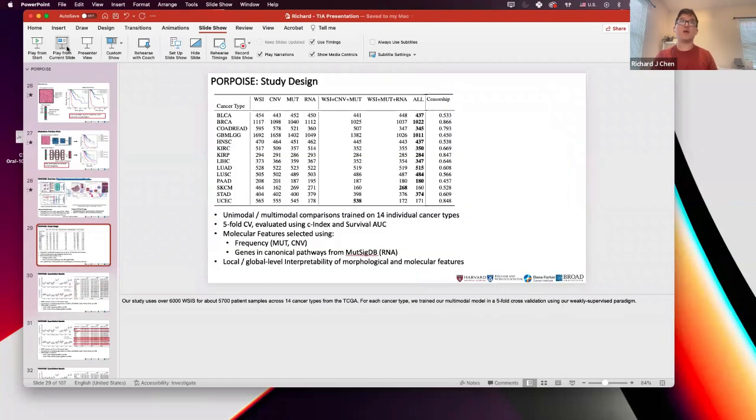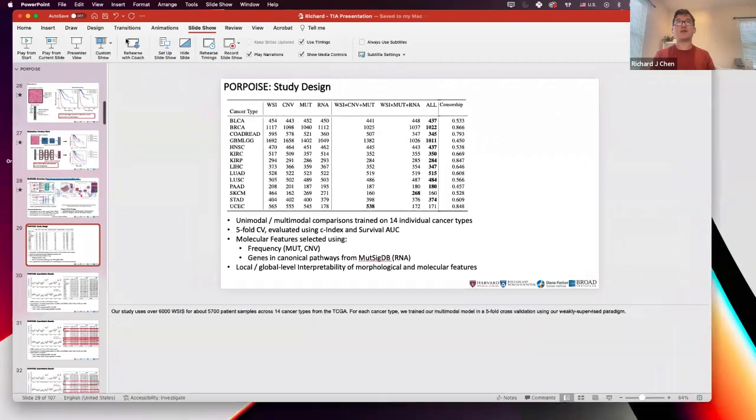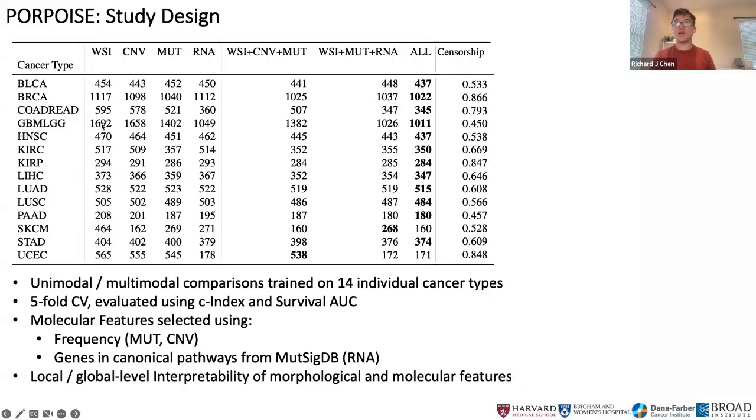In terms of how the duration of different survival distributions affects survival, the way that we've been training and evaluating these survival methods is just via C index, which looks at just the ordering of survival times, but not necessarily the actual calibrated time distances, such as 1 month versus 10 versus 10 months.